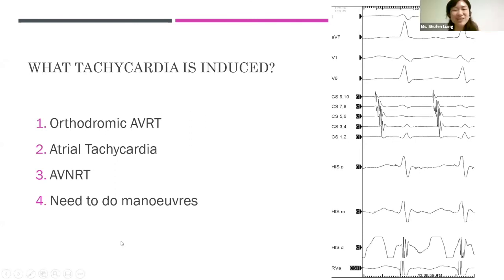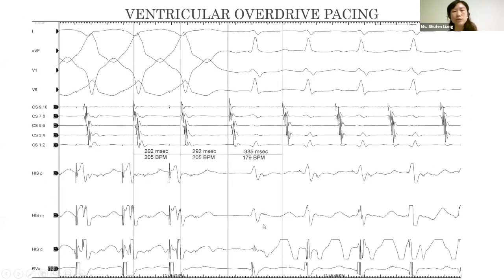So, actually a lot of the audience polled AT, but almost an equal number said that we should do more maneuvers. Okay, so did I do many? So here, I'm being lazy. I'm only making sure that AA is entrained actually.